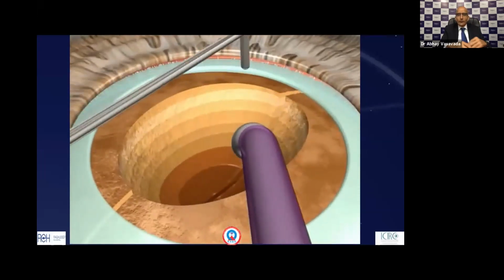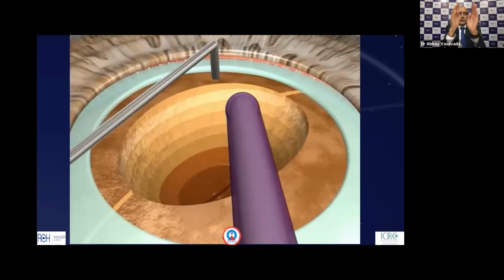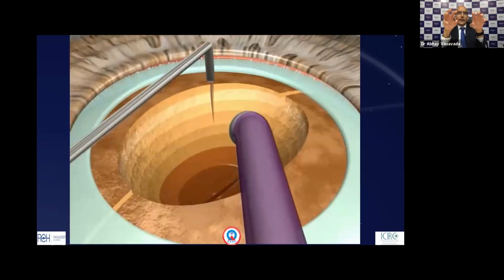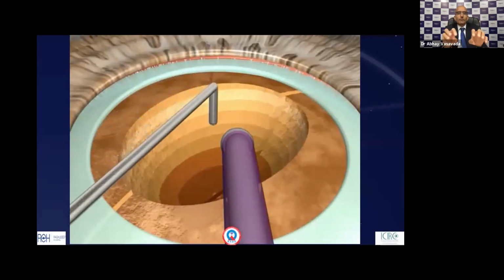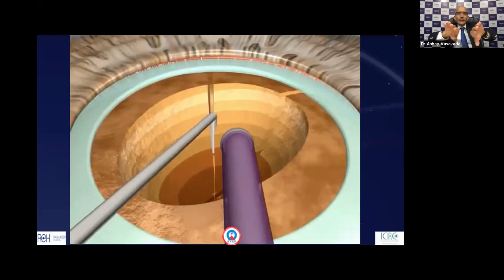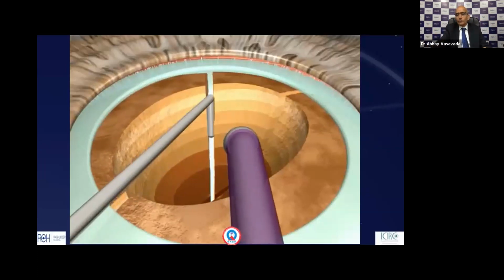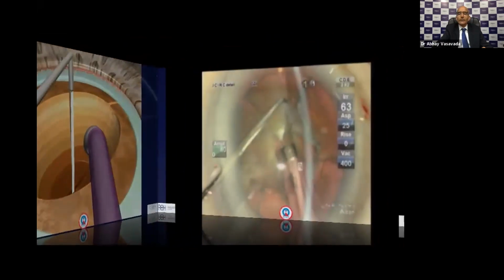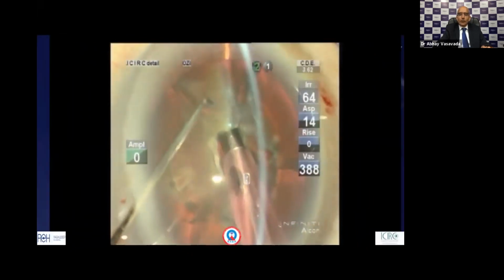And if you try to divide the bottom plate working from the front of it, you need to torque the eye so much. So apply that at one level and then go back to the deeper level closer to the bottom plate, so your separating forces are minimized. So in compromised zonules or in a bulky cataract, the bag is overstretched. This principle of multi-level chop really has a very good advantage that the zonules are not affected.